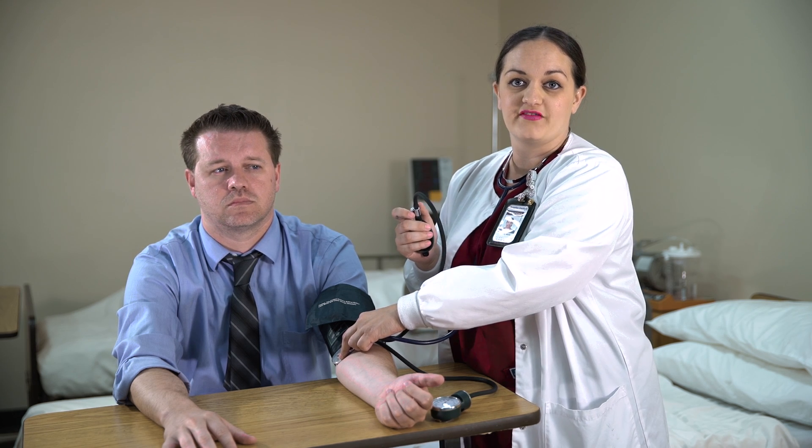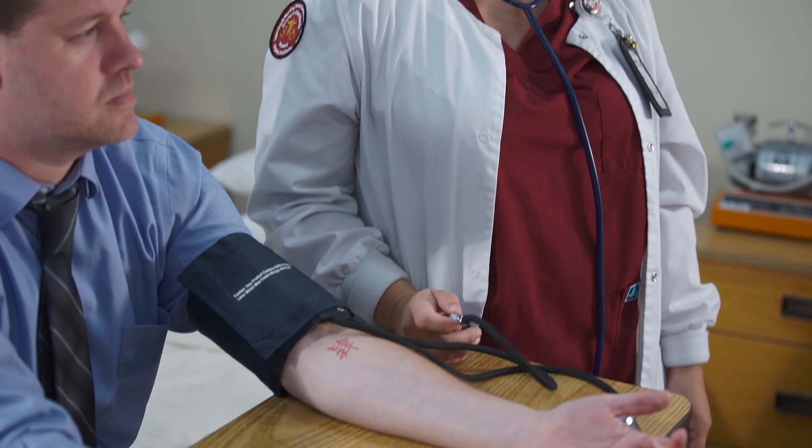Once at 160, partially unscrew the valve counterclockwise to deflate the bladder at two millimeters per second while listening for the first sound. The sound is called the Korotkoff sound. The very first sound you hear is the systolic blood pressure. The last sound you will hear is the diastolic blood pressure. Once you get your reading, deflate the cuff rapidly and completely. Do not reinflate the cuff if you let the air out too fast — you need to deflate the cuff and restart all over again.